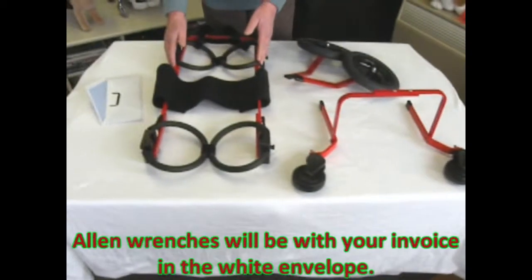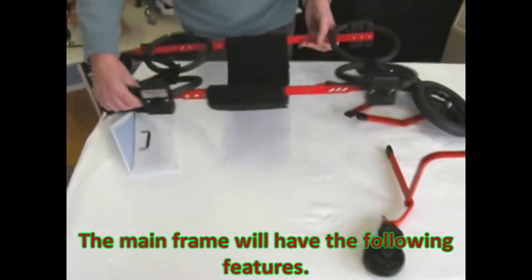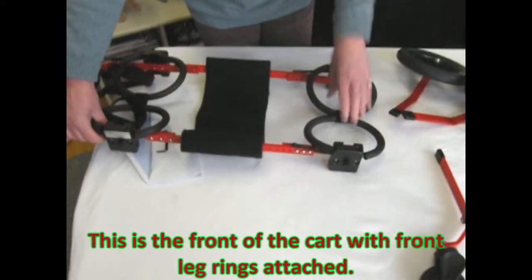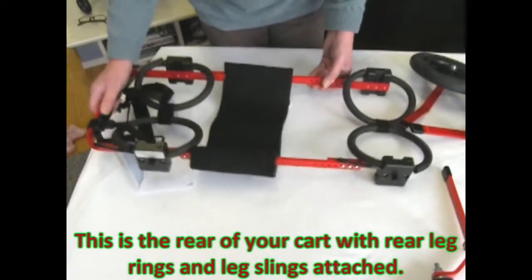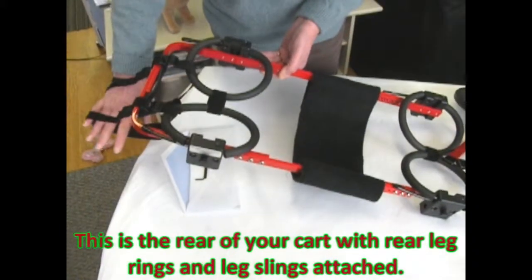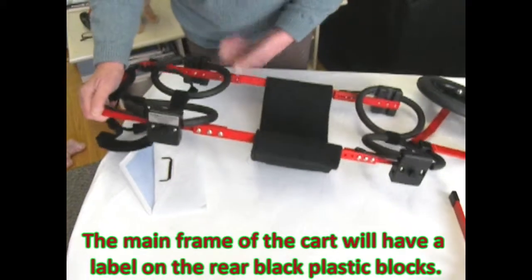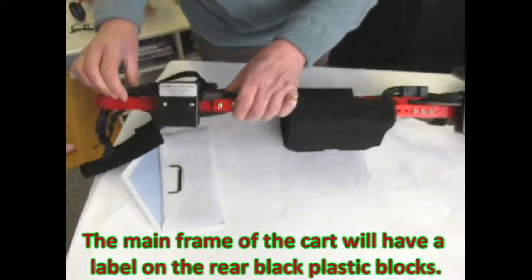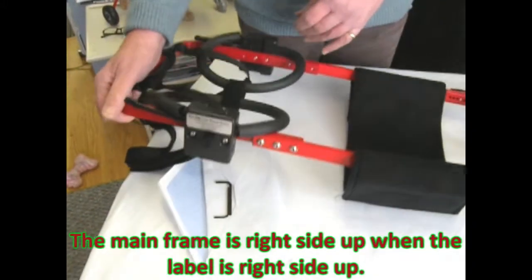Allen wrenches will be with your invoice in the white envelope. The mainframe will have the following features. This is the front of the cart with front leg rings attached. This is the rear of your cart with rear leg rings and rear leg slings attached. The mainframe of the cart will have a label on the rear black plastic blocks. The mainframe is right side up when the label is right side up.